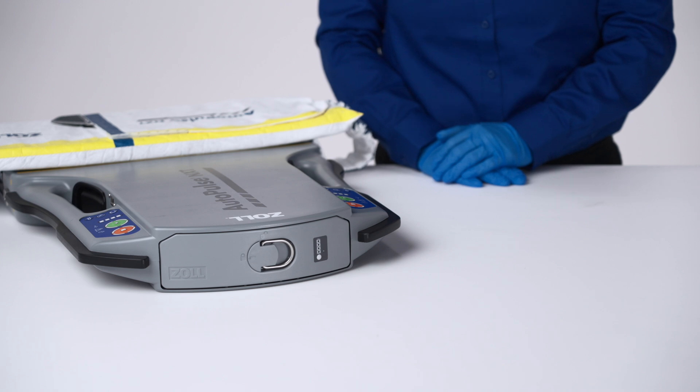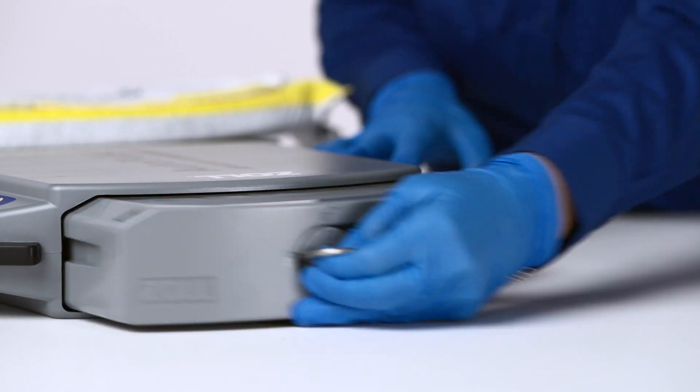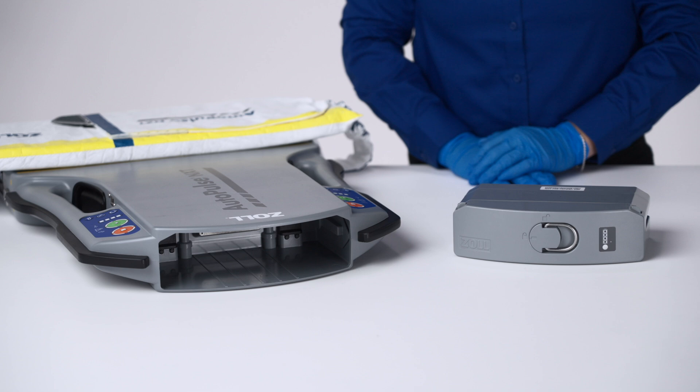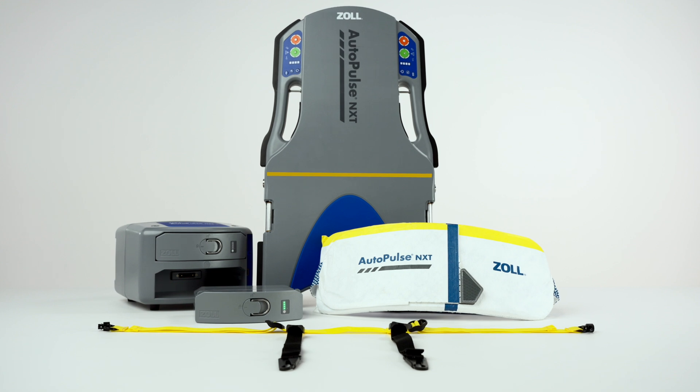Should you need to remove the battery, lift the finger ring and rotate it clockwise to the unlocked position. Hold the platform firmly and pull the battery out until it is clear of the battery compartment. We have now reviewed battery installation and removal for the AutoPulse NXT Resuscitation System.